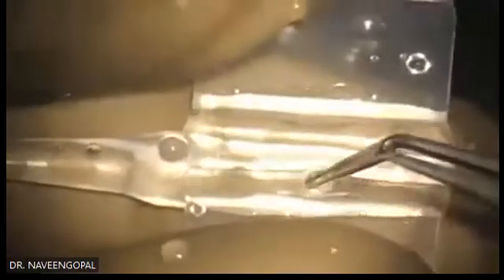Can you see how I'm loading? Make sure the edges of the ICL are inside the ridges. Can you see these two ridges, on your side and opposite to your side? Make sure the edges of the lens are below this ridge. That is very important first. Especially the edges of the lens should be below. Don't touch the middle. The middle is the thinnest part of the phakic lens. Don't touch it. Once you have loaded it, just press it gently and close it.